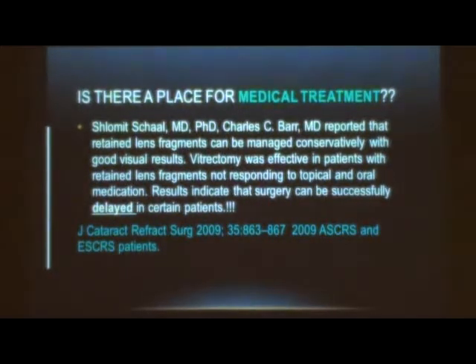So now you have put in your IOL, or you left the patient aphakic, and you have a dropped lens matter. There is a place for medical treatment. One study, published again in the Journal of Cataract and Refractive Surgery, reported that retained lens fragments can be managed conservatively with good visual results. Vitrectomy was effective only in patients with retained lens fragments not responding to topical or oral medications. And the results indicate that surgery can be successfully delayed in certain patients.